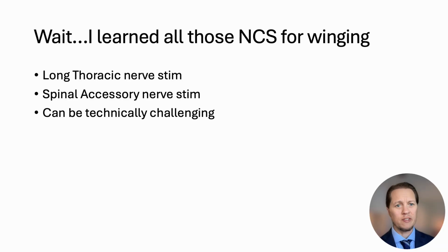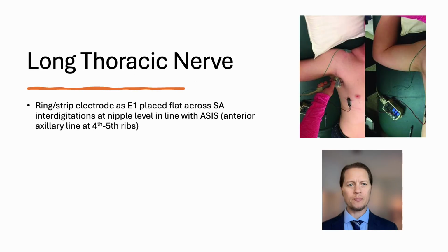Now, some of my students have said, hey, wait, hang on. All I know is median and ulnar motor. You got to review this in a little more detail. How do you do all those? And we're going to go over them right now. They can be a little technically difficult to do and actually rather unpleasant if you've ever had it done on yourself. We're going to review it right now. Not so much fun. So how do we do long thoracic nerve?